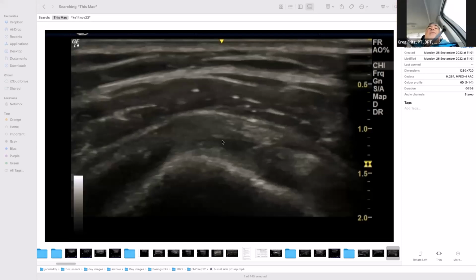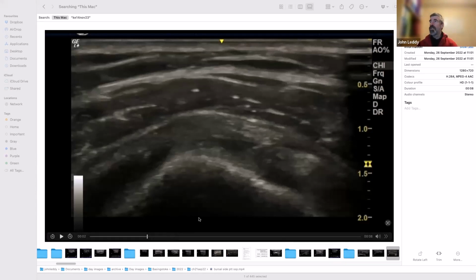In the direction of the middle facet? Well, you've got the attachment of supraspinatus, where you've got biceps in the corner here. And you've got the bulk of supraspinatus, that anterior portion, 7 millimeters or so of thick tendon. And I've got some good examples. I'm not sure why they haven't popped up for me to look through.